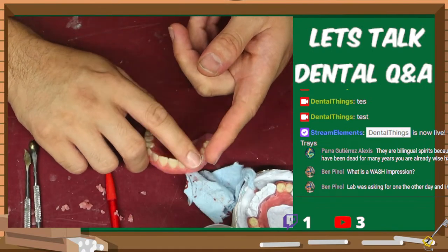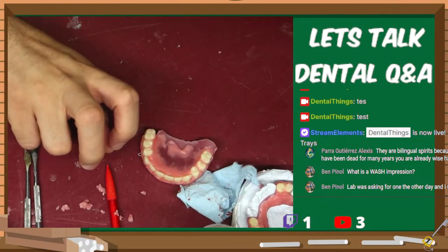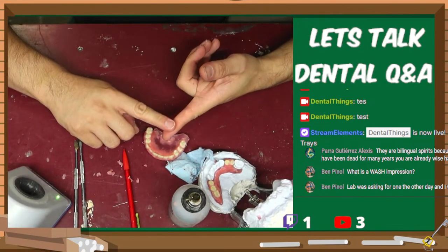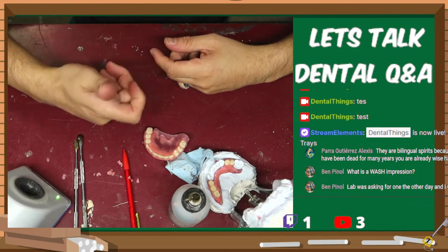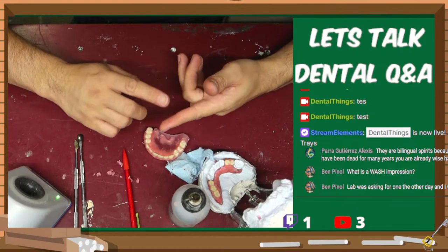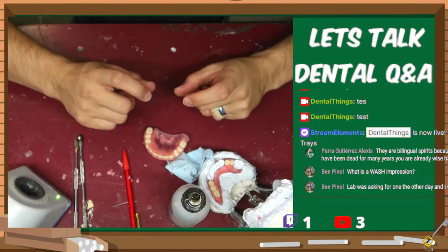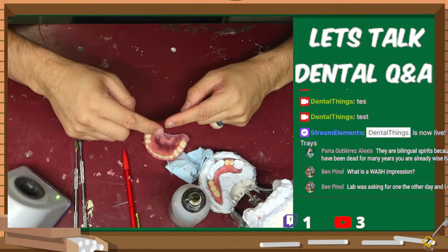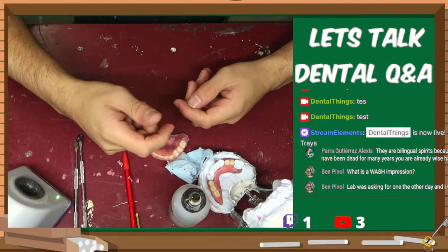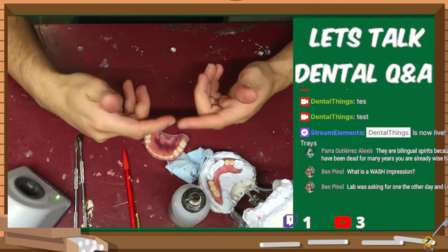Okay, hold on. So, the term wash just means using the light body. If you're using a light body impression material, pretty much what the doctor is squirting on the tooth, that's what they're asking for. The only reason I think they would ask for a wash impression is because they want a super detailed, fine impression of the margin of the tooth. But you guys already do that. You do wash or light body, and then you do tray material or heavy body, and you just exchange the guns, right?